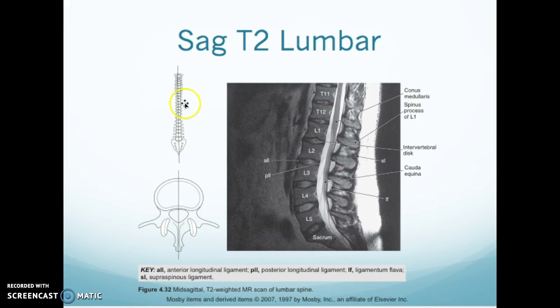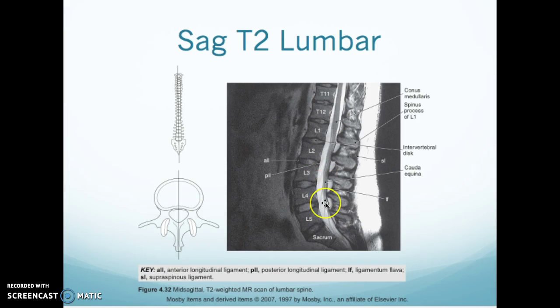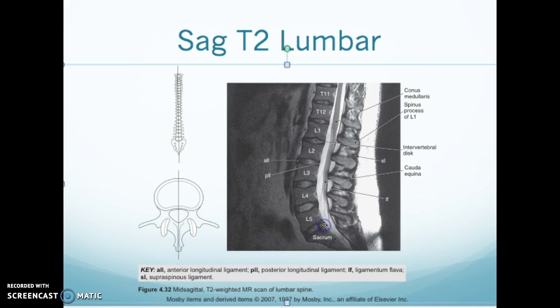Here is a sagittal T2 lumbar. When we count we go 5, 4, 3, 2, 1, then T12, T11. You can see here is your conus medullaris — where the actual spinal cord ends — and then it goes into your cauda equina below. The cauda equina translates to horse's hair; it just free-floats within the CSF. You have your annulus fibers and your nucleus, and we're looking at the anterior longitudinal ligament. There's a ligament running anterior and a ligament running posterior to the vertebral body.